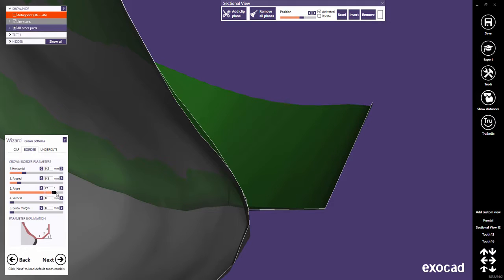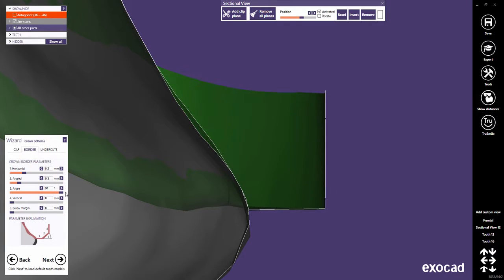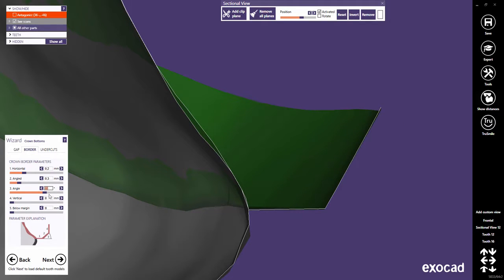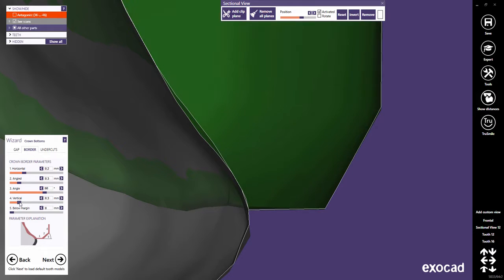Angle defines the angle for the angled part. Vertical defines an additional vertical border. Commonly, this value is also set to 0.